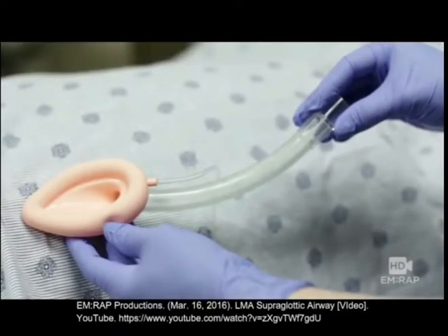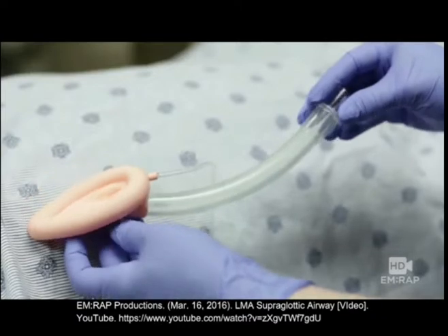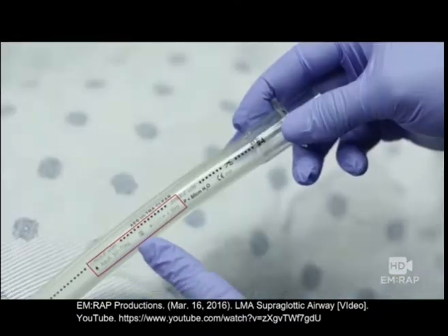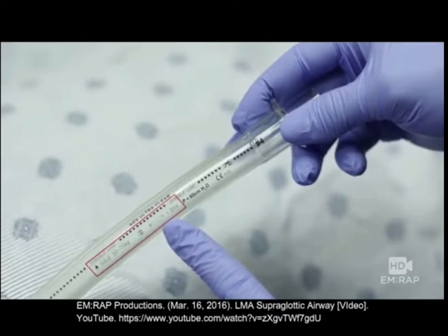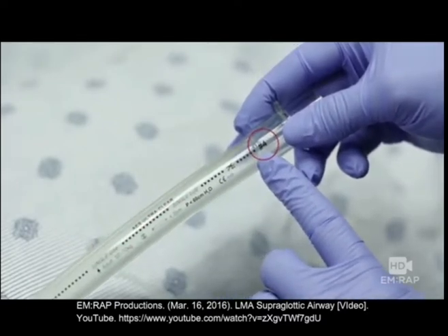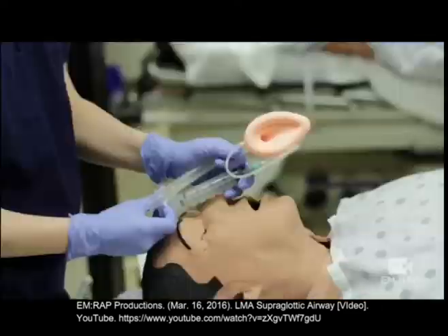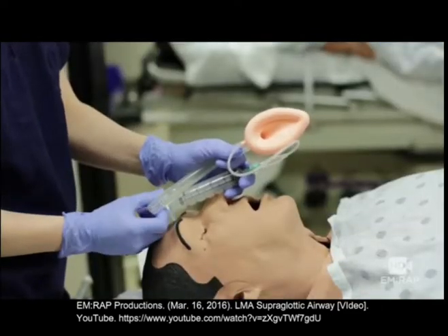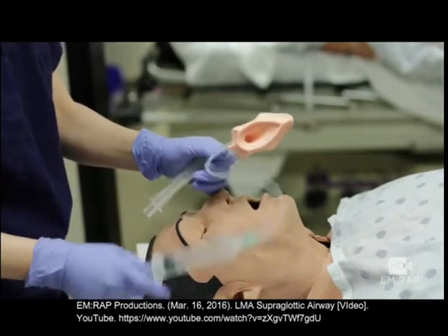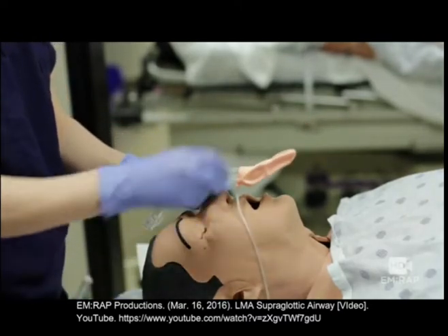Here's an LMA. Take a look at the tube portion, and it's going to show you the weight of the patient right there, the amount of air needed to inflate the mask, and the corresponding size. This is a number 4, which works well for most adults. To insert it, first you're going to deflate the mask, and then it helps if you get some lubrication on the back of it.